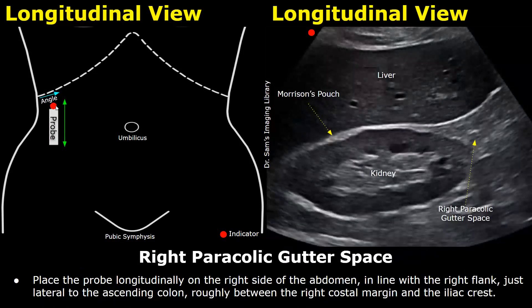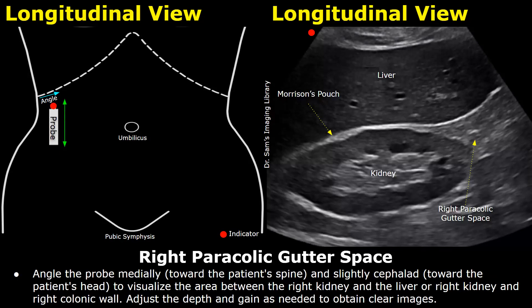Move the probe downwards and position it roughly between the right costal margin and the iliac crest to scan the right paracolic gutter space — the area around the inferior pole of the right kidney and the inferior margin of the liver. Free fluid may also be found in this region. You can angle the probe towards the patient's spine and slightly towards the patient's head to help locate the right paracolic gutter space.